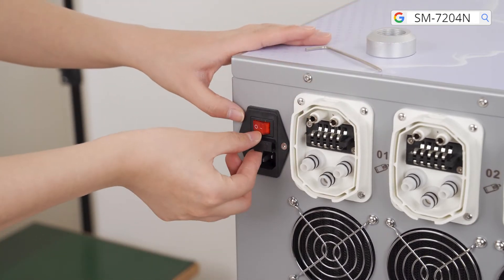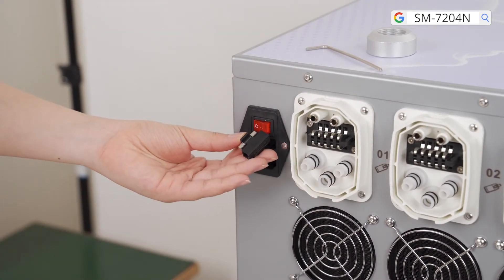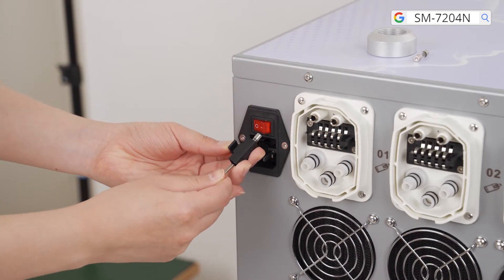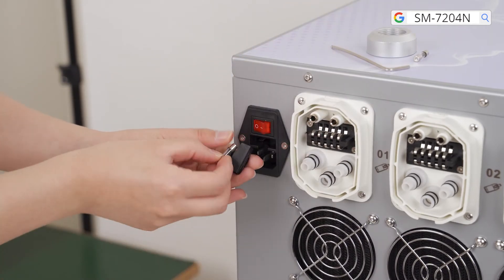There are two spare fuses which can replace the broken one in the machine. When the fuse in the machine is broken, use a screwdriver to take it out and replace it with a spare one.